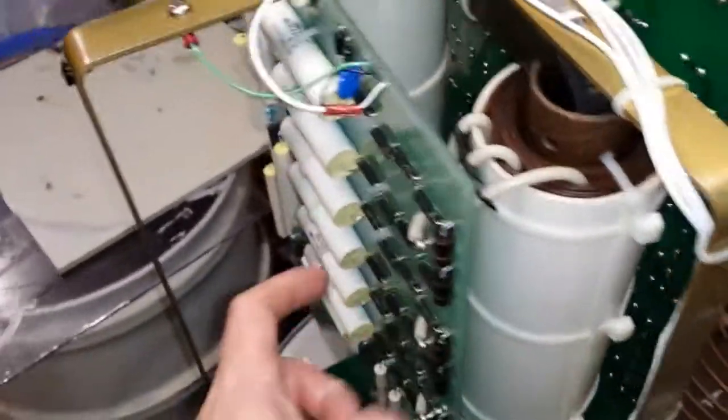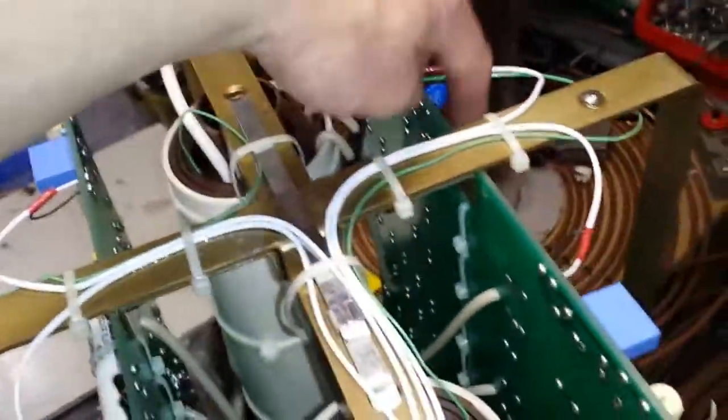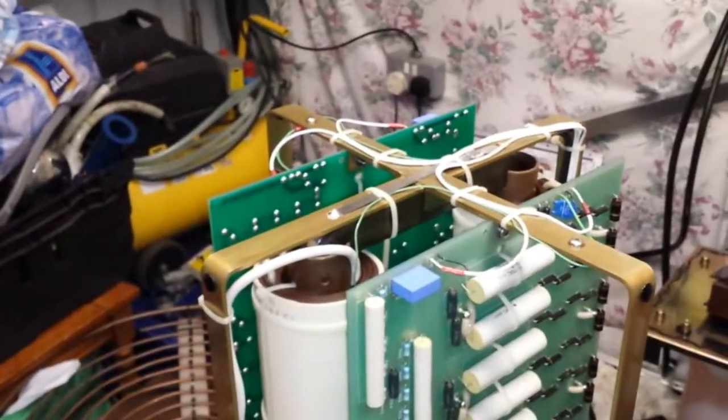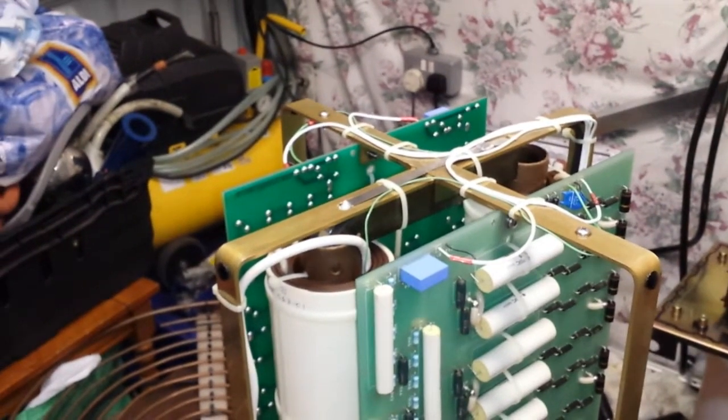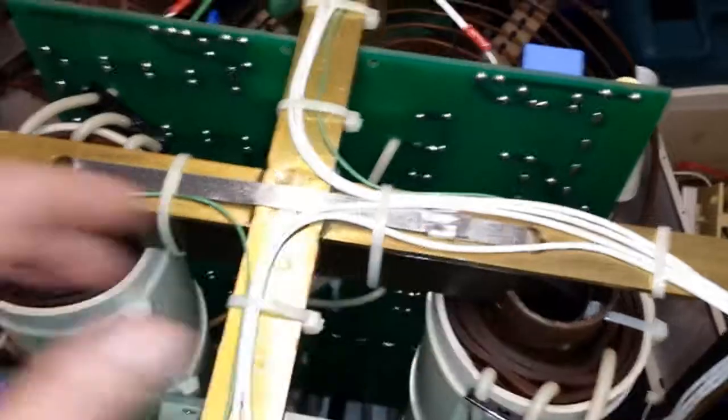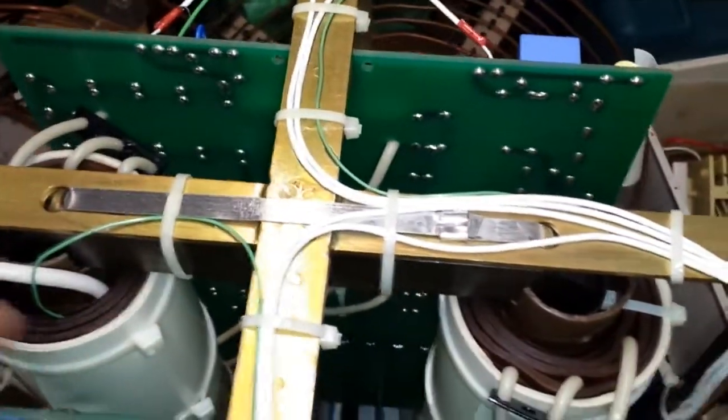You see there, one side, one transformer will go to this one, and then the other one will go to this one, and then they'll obviously join in series. So, damn well nice. It's actually too nice to really take down. I'm in two minds whether to strip this down or keep it, because I do like the array of how it's put together. And this iron core pulse transformer, frequency transformer, which will run on frequency.